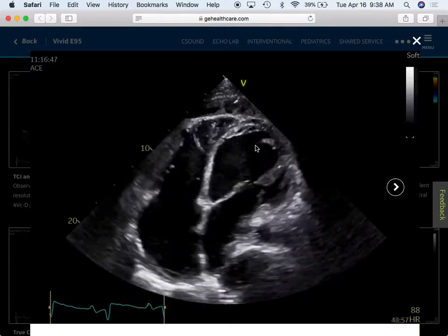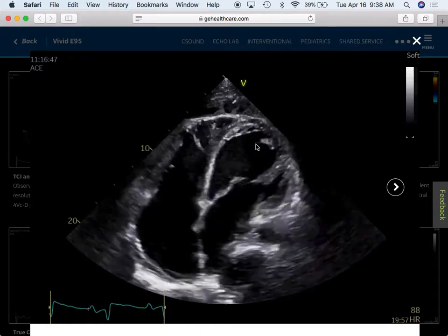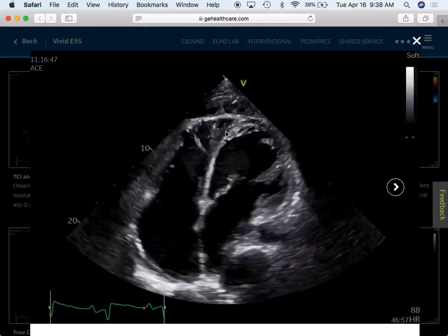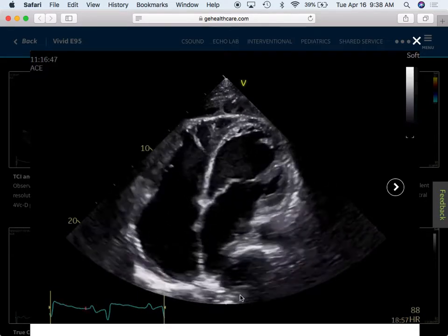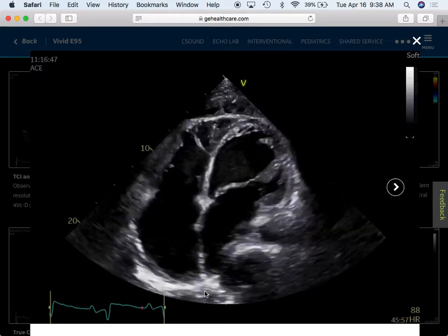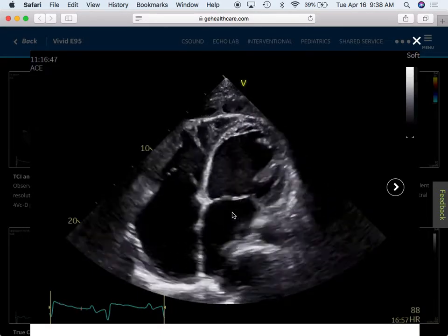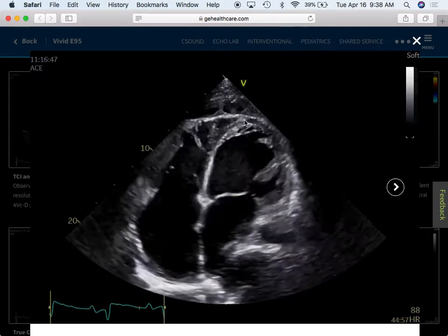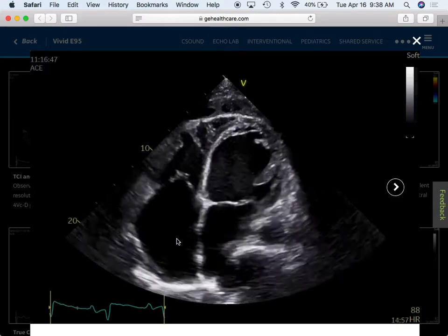Can you tell me, or let's look at, say, spatial resolution of these images. Obviously, it's a sequence of images played back in time. As we move away from the transducer, you take a look at the detail that you can see here versus the detail you can see down here. There's a pretty obvious depth dependence on image quality in this modality. Obviously, we can make images fairly quickly because we're playing these back at, I don't know, 15, 30 frames a second or something, and we're seeing a movie, right?